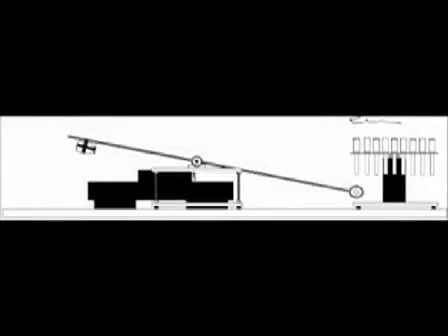TAPS uses gravity to press a stimulus surface against the skin. Gravity exerts a downward force on a mass hanging from a rod. This side view shows TAPS with several structures removed in order to clearly illustrate the functioning of the device. The participant's arm rests comfortably in prone position on a tabletop. The fingertip lies over a tunnel in the table. The tunnel is not shown in this diagram.